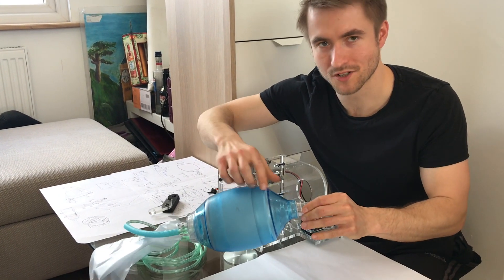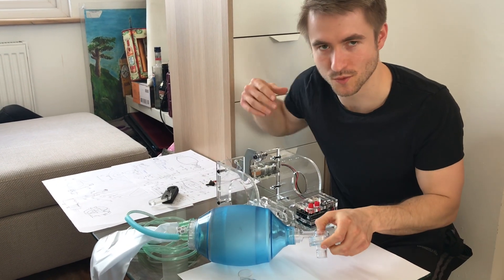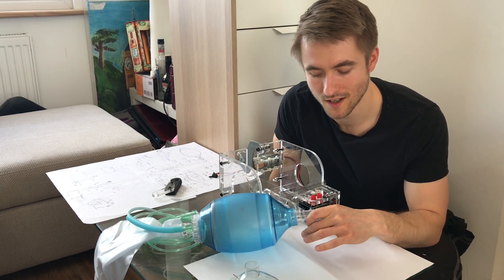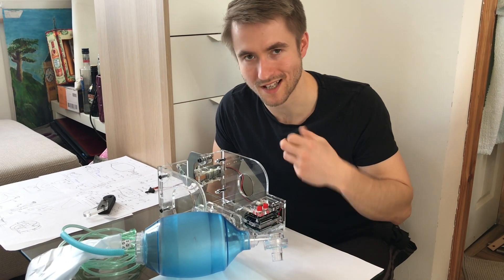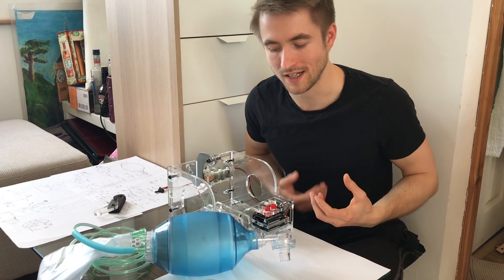There is one thing extra that needs to be added to make this a complete medical system, which is a PEEP valve — a valve that connects to the exhaust down here. It restricts the minimum pressure that this can put into the lungs at any one time, and that's needed for COVID-19 because you need to make sure the lungs are always completely fully inflated.